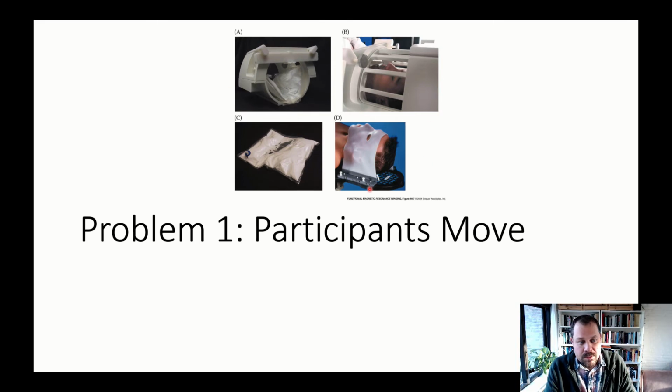But there are different methods to keep the subject locked in. One is this rubber mask, which straps around the face. That's a bit extreme, I would say. Another one is a bite bar that is shoved into the mouth of the subject and keeps the subject in place, also a little bit extreme. So we use this method here.